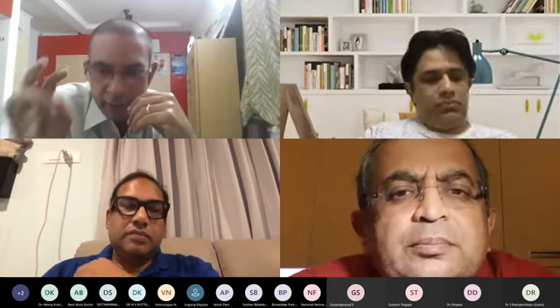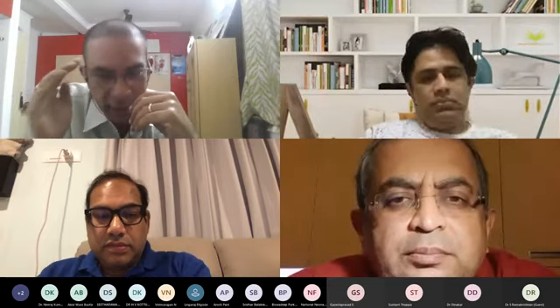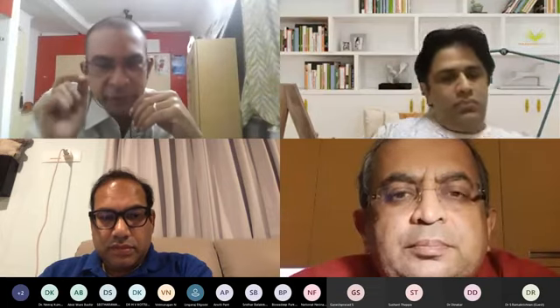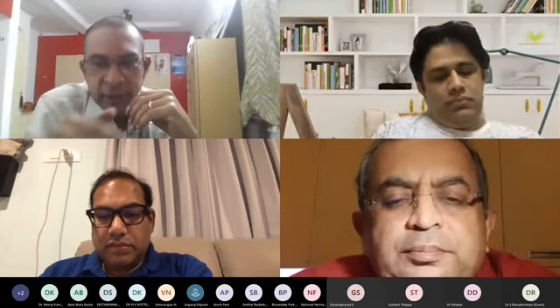One more small point here. You said accuracy, serviceability, durability. The last point is safety. How safe is your equipment when there's an occlusion, or when the syringe is near empty? How fast, how proactively does it give an alarm? Those are very important things which we really need to see practically before we decide on the pumps. Correct. Yes, safety of the patient is more critical.